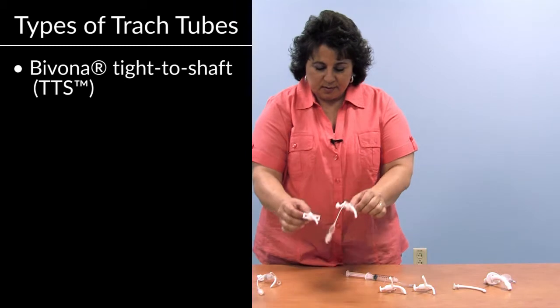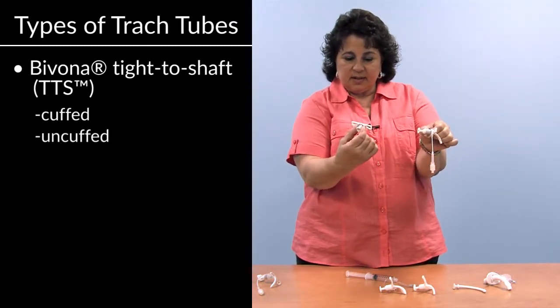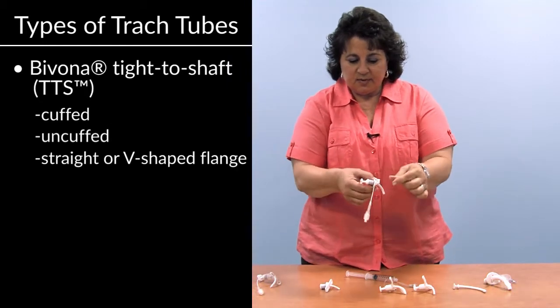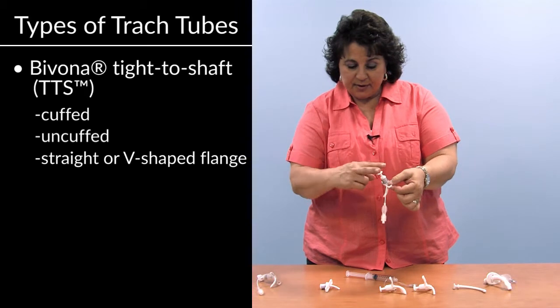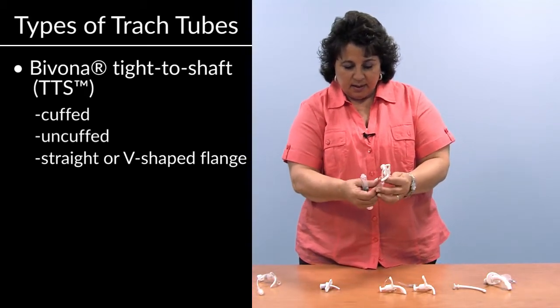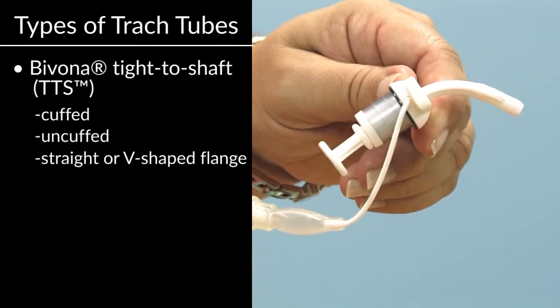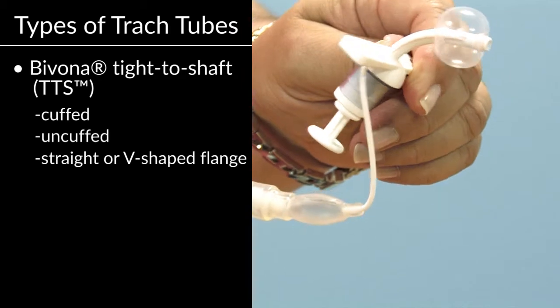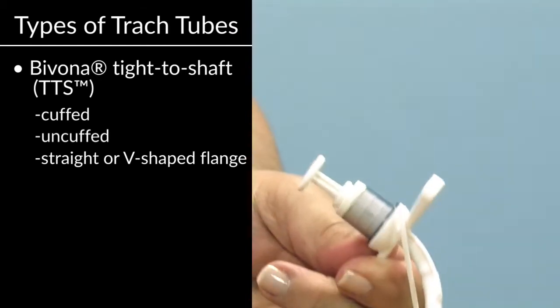These are the Bivona tight to the shaft technology. This is cuffed, this is uncuffed. The flange comes available in both a straight and a V fashion. We don't carry the V fashion here at Children's, but it is available from the company. And as you saw earlier, this is what's called tight to the shaft technology, so that when I inflate the balloon, it appears. When I deflate it, it disappears.